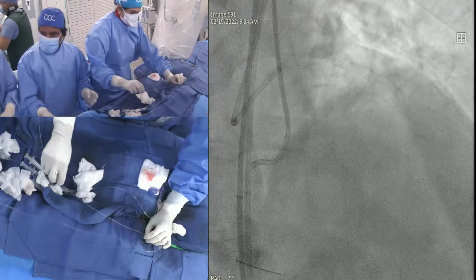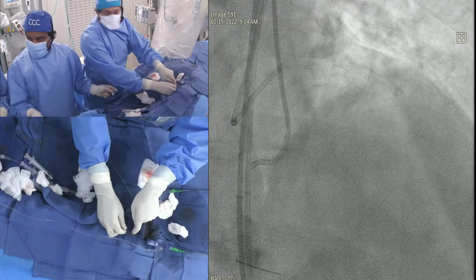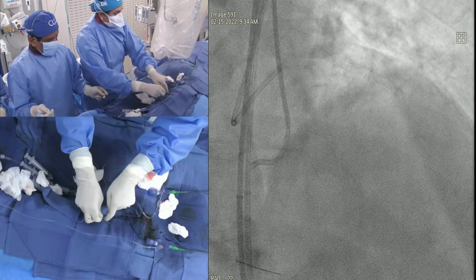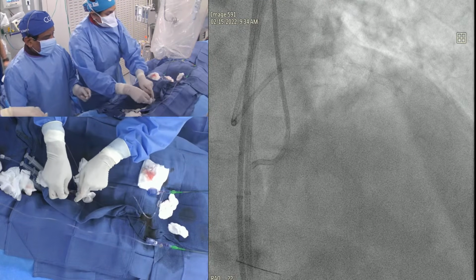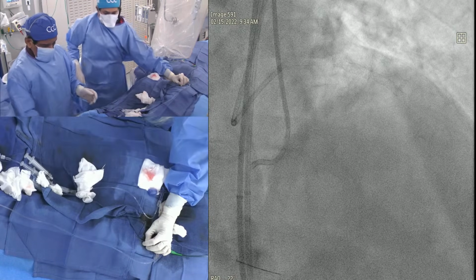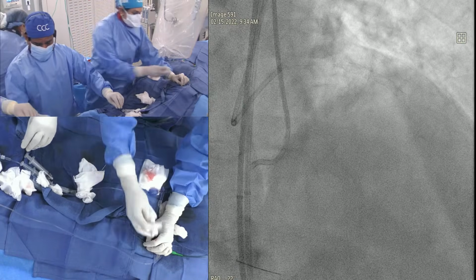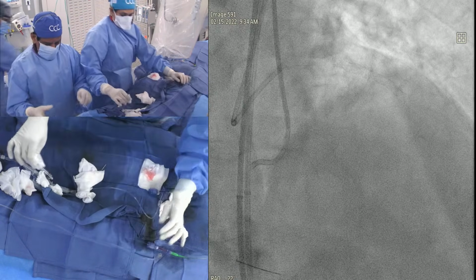Turnpike LP. Gold or LP? LP, yeah. We don't carry gold. LP we carry. So Turnpike has various varieties. They're all shown in that guide wire app. Okay. Flush. Let's see.